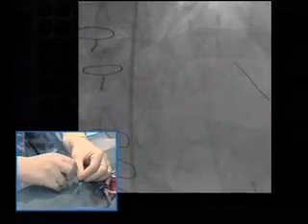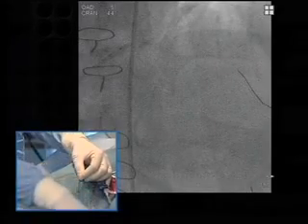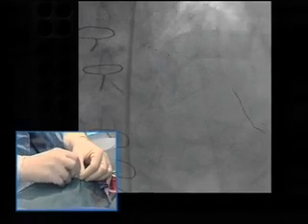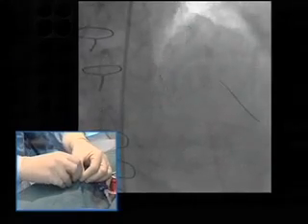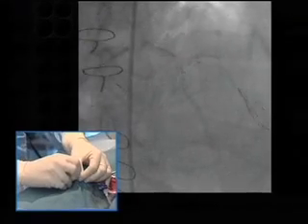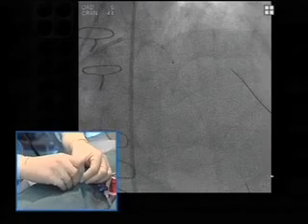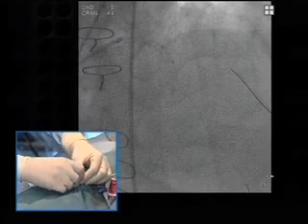And let's say there is a price to pay when you put two stents, which is the higher risk of stent thrombosis. So what he's doing at the moment is pre-dilating the main branch. It's Philippe Garot, my partner, who is working with me.